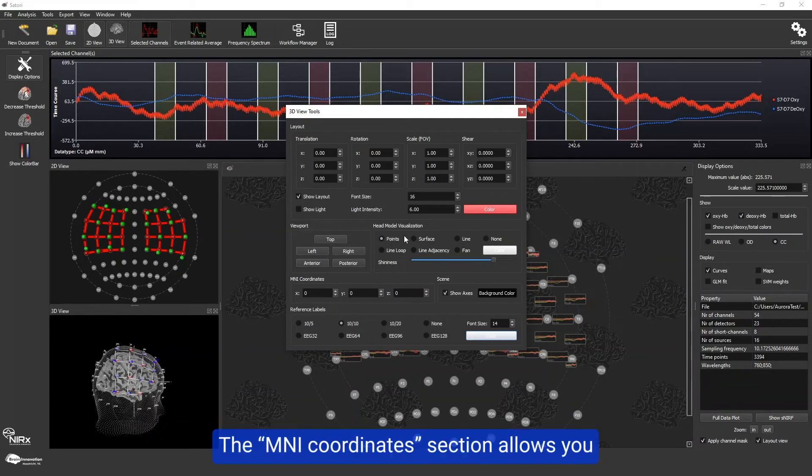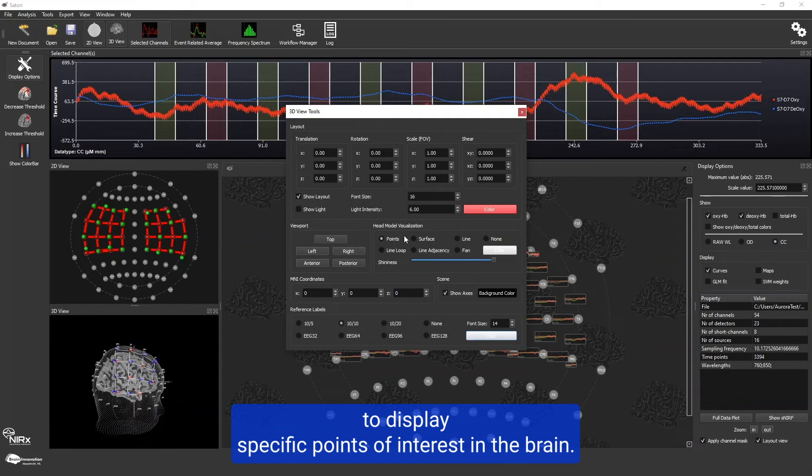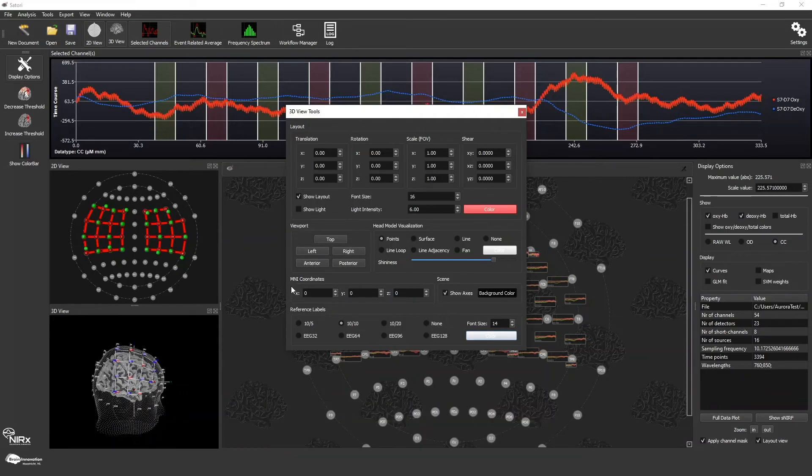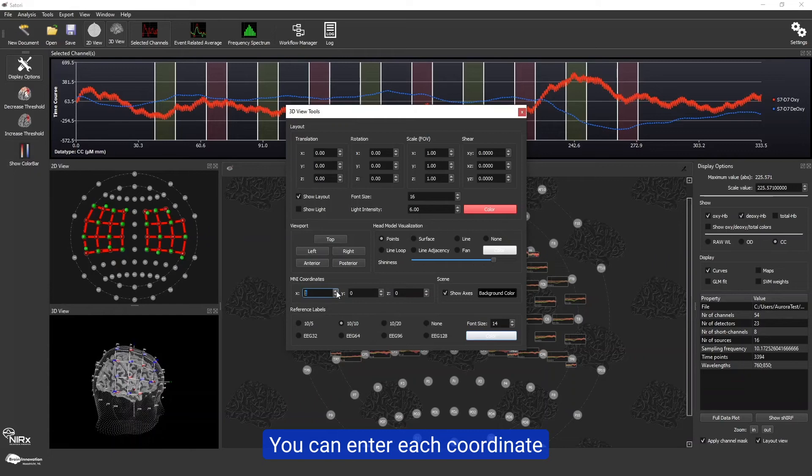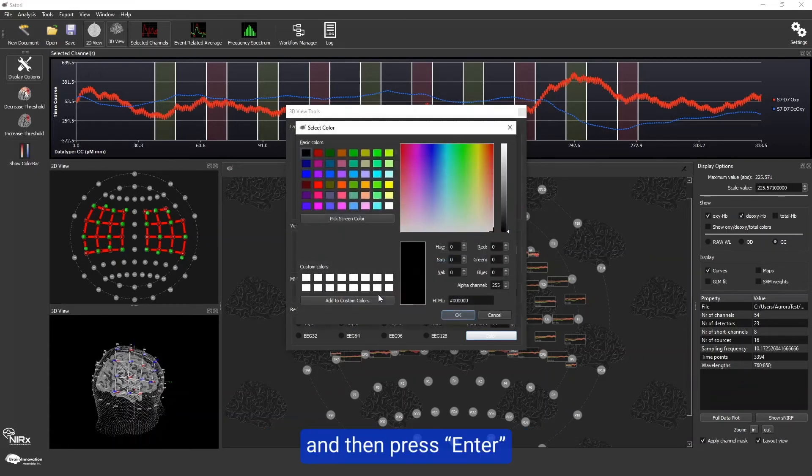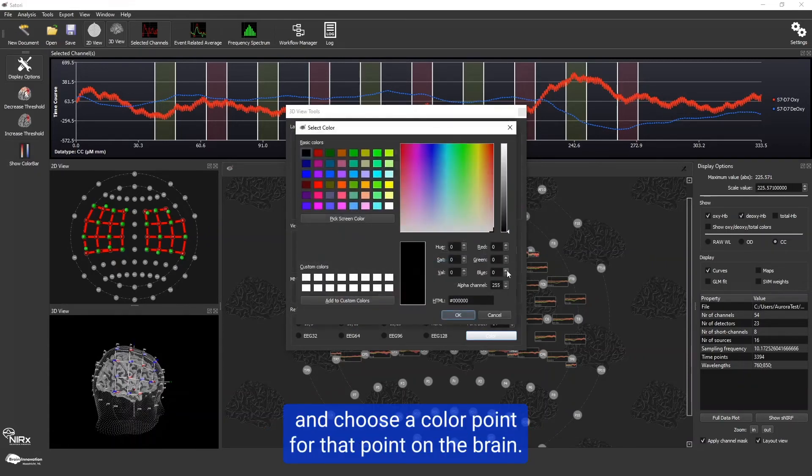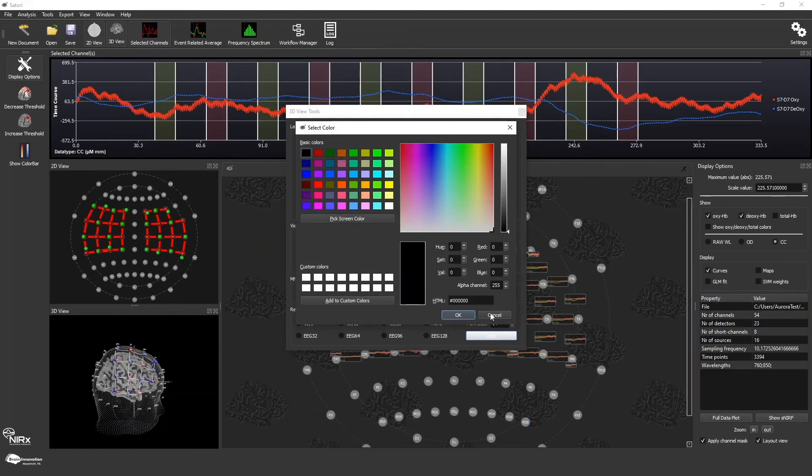The MNI coordinate section allows you to display specific points of interest in the brain. You can enter each coordinate and then press enter and choose a color point for that point on the brain.